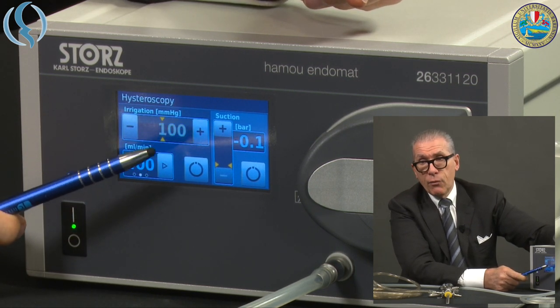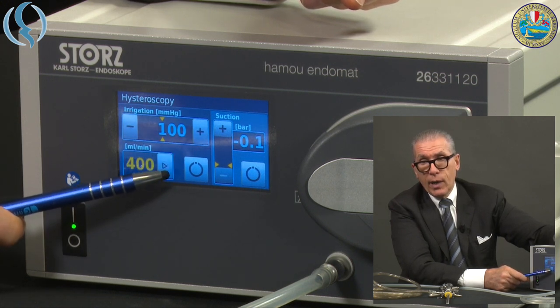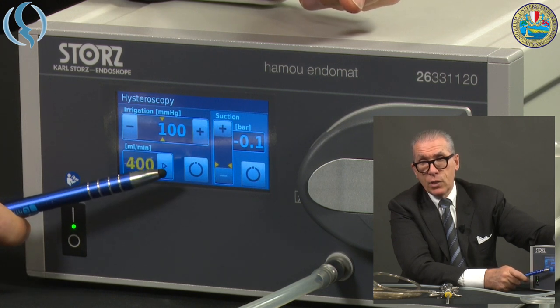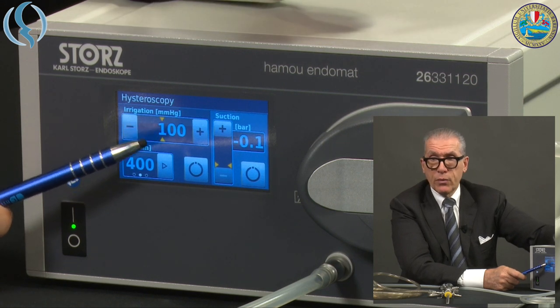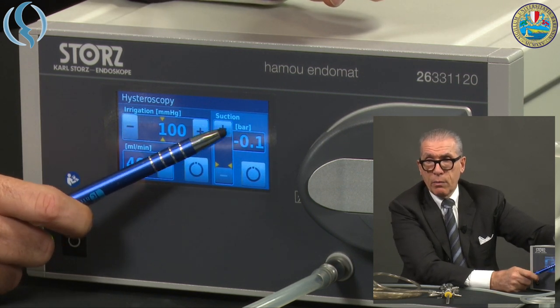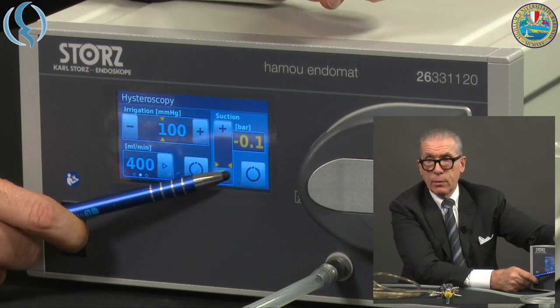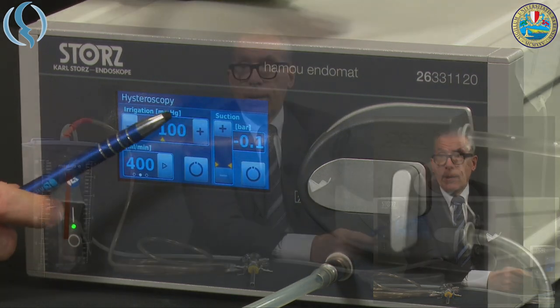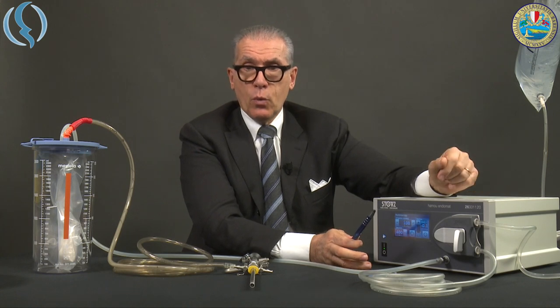Regarding the flow, there are only three available settings: 200, 400, and 600 ml per minute. I suggest staying in the middle with 400, which is quite close to the previous model. Also, the suction bar should be modified, and it is advisable to stay at the minimum — 0.1 bar. Once done, the machine is ready to work.